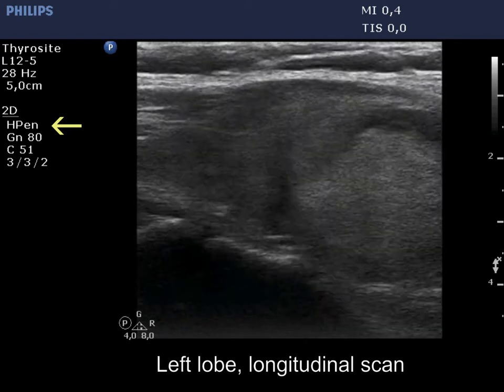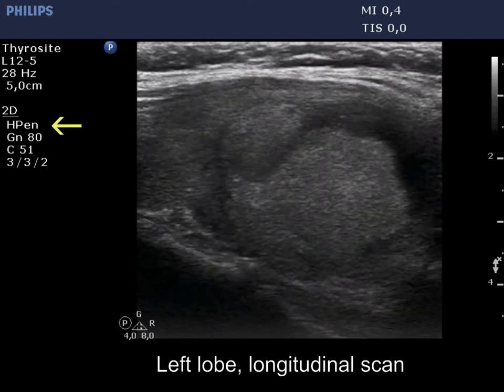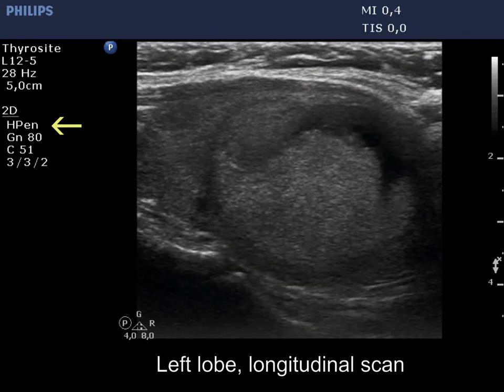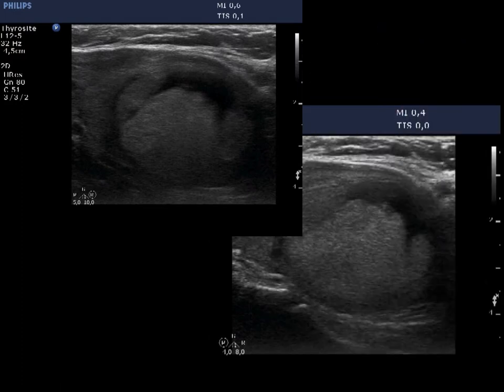If we compare the two settings, significantly smaller portions are difficult to judge with better penetrance (right lower image) than with better resolution (left upper image).